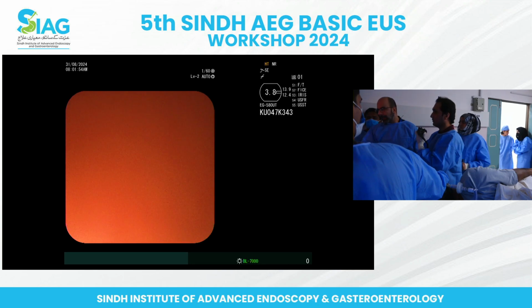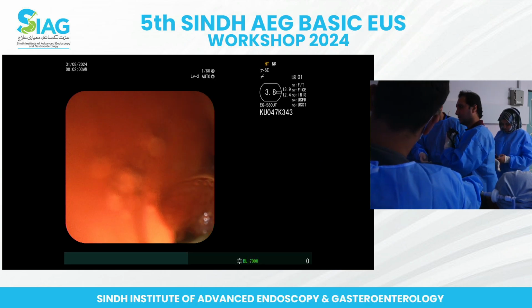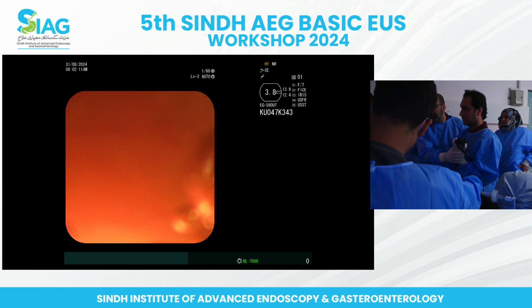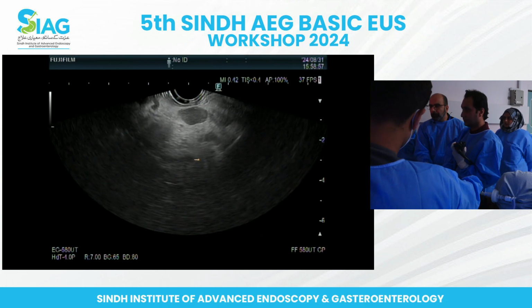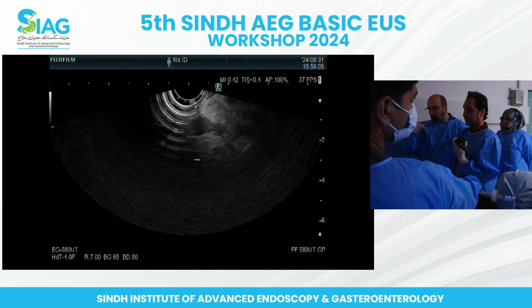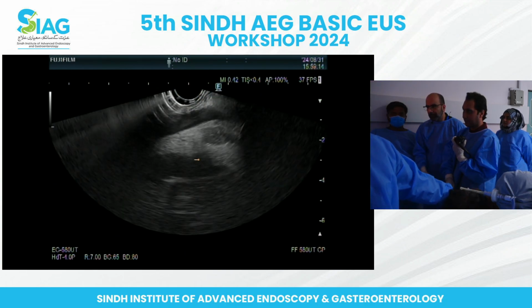So if you're not sure, now what I do, basically good, you already did that, so turn clockwise, good, and now you're like, good, the mesenteric vessels, big wheel towards you. I usually will bend this down for stability, so no, just straight down, like this. And there you see lymph nodes already, right? So these are peripancreatic aortocaval lymph nodes. Now you're going to pull back. We can sample these too, because I think that's what they reported on the imaging too. So now go clockwise towards uncinate and pull back some. Good. Keep pulling back. Keep going clockwise for a second.